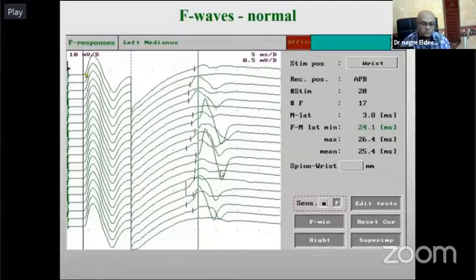We stimulate the nerve distally and record the CMAP first, and then with a higher gain, we see late components. If the gain is, for example, 10 millivolt per division here, it is 0.5 millivolt per division here, since these are very small signals. We repeat this in our laboratory 20 times, in other laboratories 16 or 10 times, but it should be many times to let the individual axons give a chance to elicit an F wave.